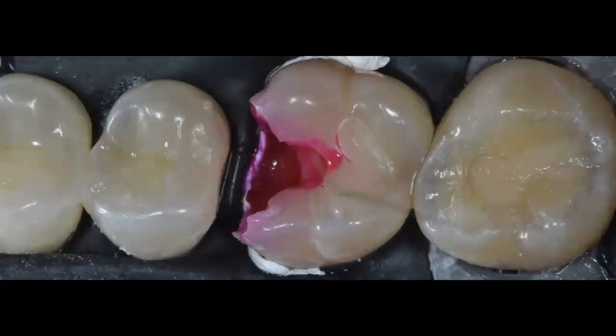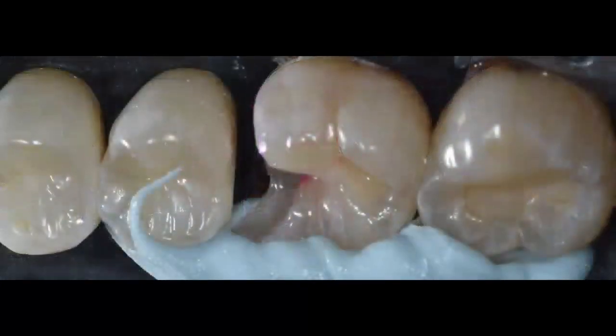And as you can see, I'm using caries detection dye. I was able to remove that unsupported enamel. I have better access to the cavitated caries lesion. By using that caries detection dye, I identify the deep caries from the more superficial caries.